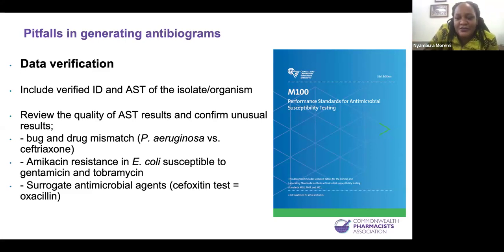So you find they have kept their antibiotics, for instance, these are for gram positive, these are for gram negative. A person will just pull from the fridge and start putting out from the mind. So sometimes you end up having those mismatches. Unfortunately, if somebody comes to analyze those data, they go unnoticed, and you end up with a poor quality antibiogram, which doesn't make sense.